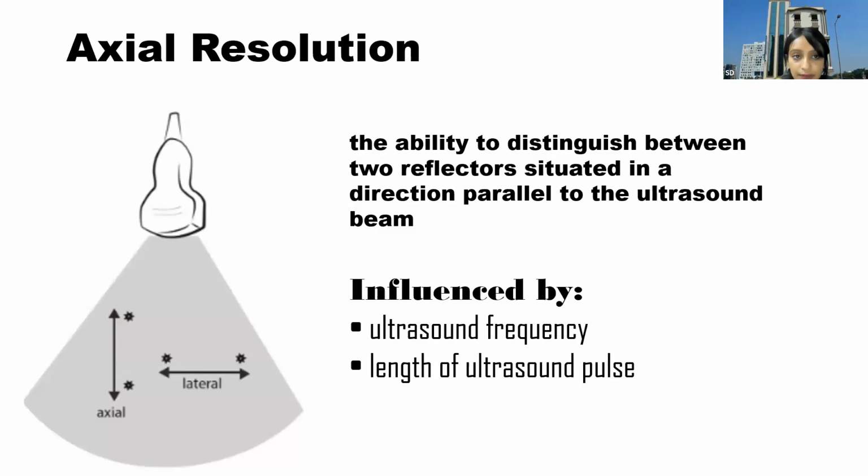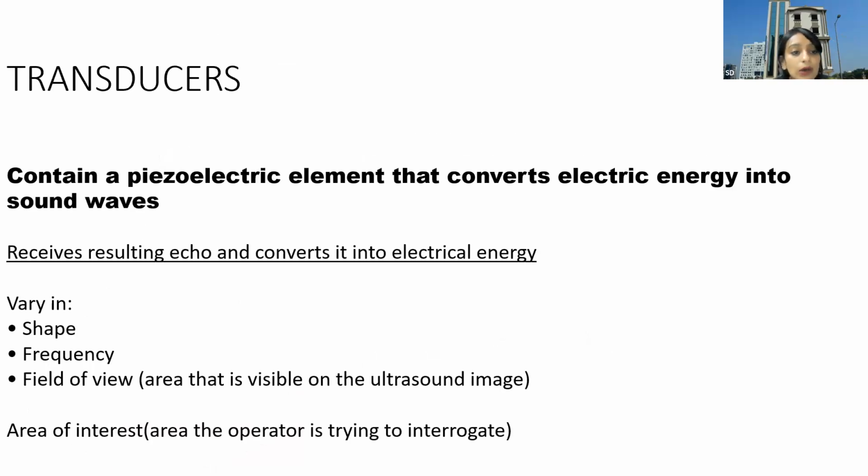This axial resolution is influenced by ultrasound frequency and also the length of the ultrasound pulse which is being emitted from the ultrasound transducer. So now coming to the transducers. What does a transducer do? We have spoken about it in my earlier slides.